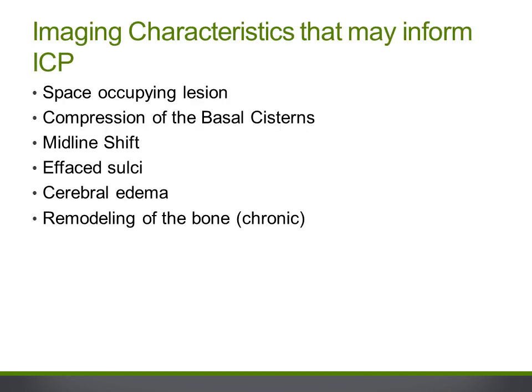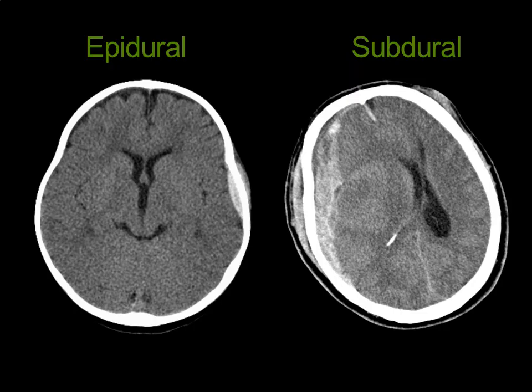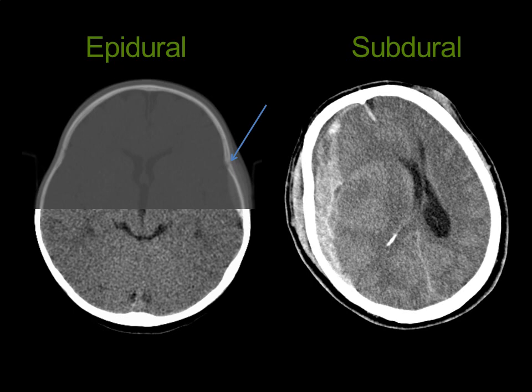Now let's look at some examples of imaging characteristics that could inform ICP. The image on the left shows a small left convexity epidural hematoma associated with a fracture through the left coronal suture, likely not significantly affecting ICP due to its small size. The image on the right shows a large right subdural hematoma with substantial midline shift, effacement of all the sulci, and compression of the lateral ventricles. Midline shift and extra-axial collection thickness of more than one centimeter, combined with assessment of the patient's clinical status, often trigger neurosurgical intervention.